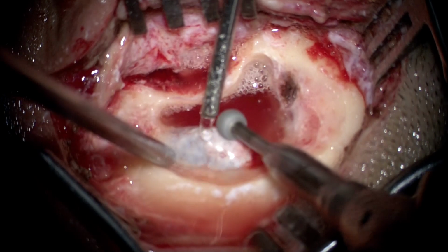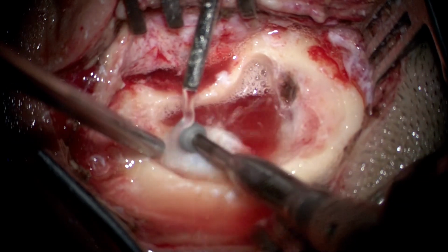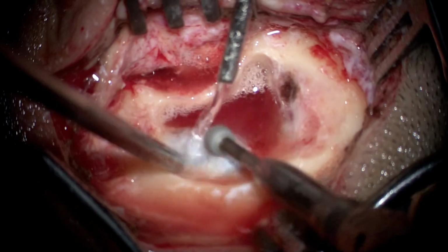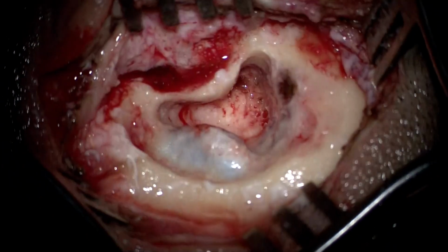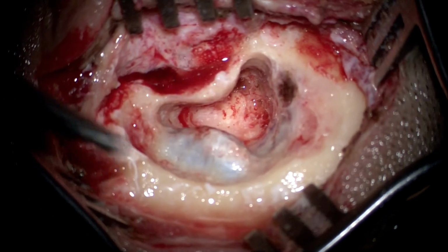We are now completely thinning the bone over the sigmoid sinus dura to the level of totally removing it. One can drill down the entire bone through this, or in the end thin it down to an eggshell thinness, which later can be removed using a broad septal elevator.